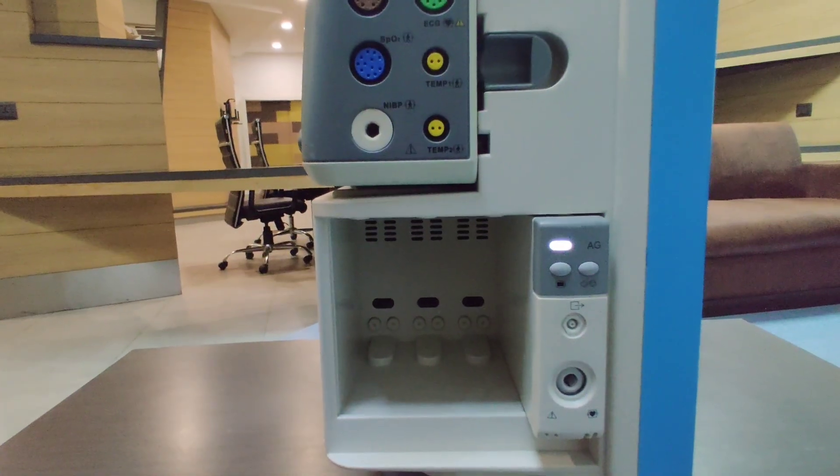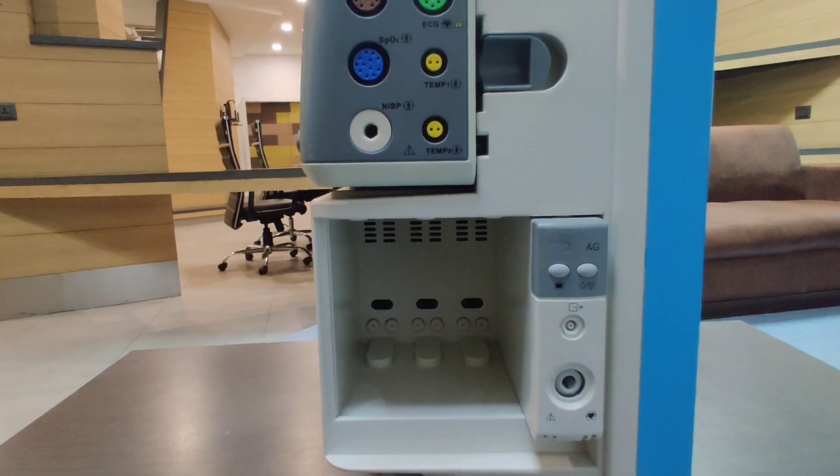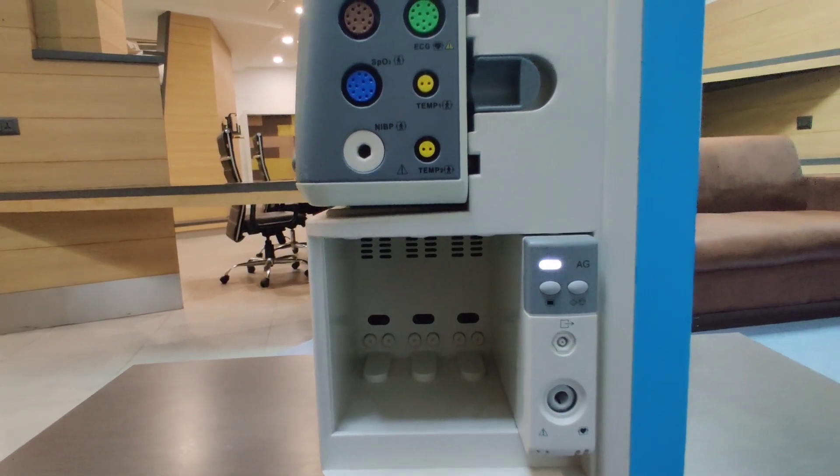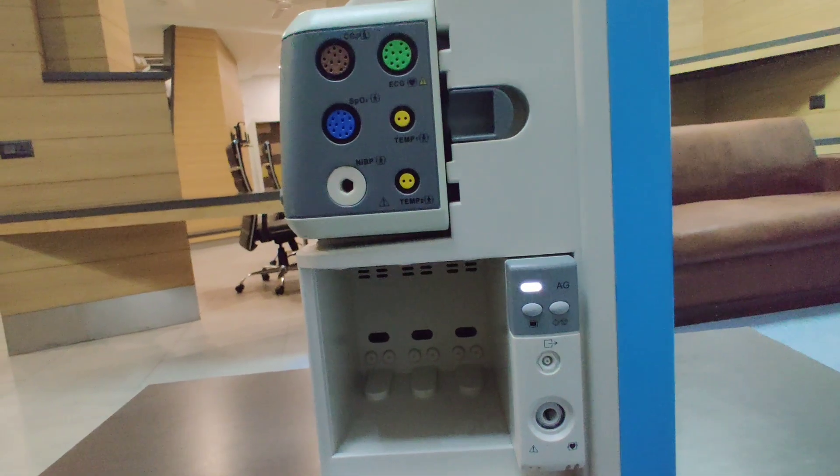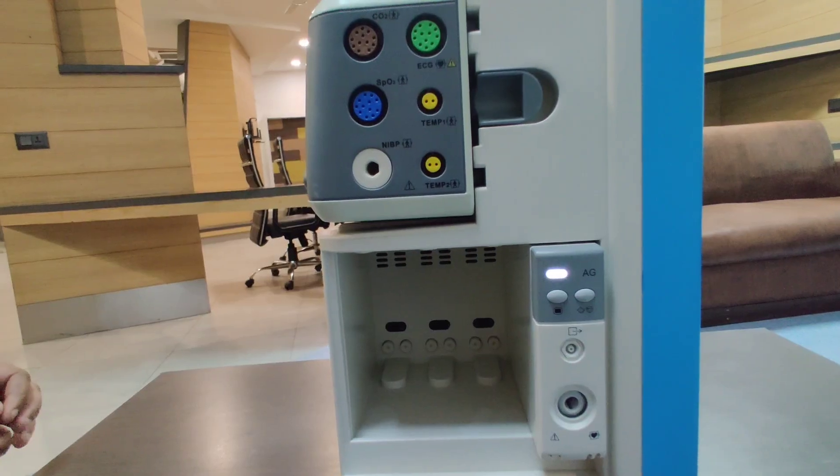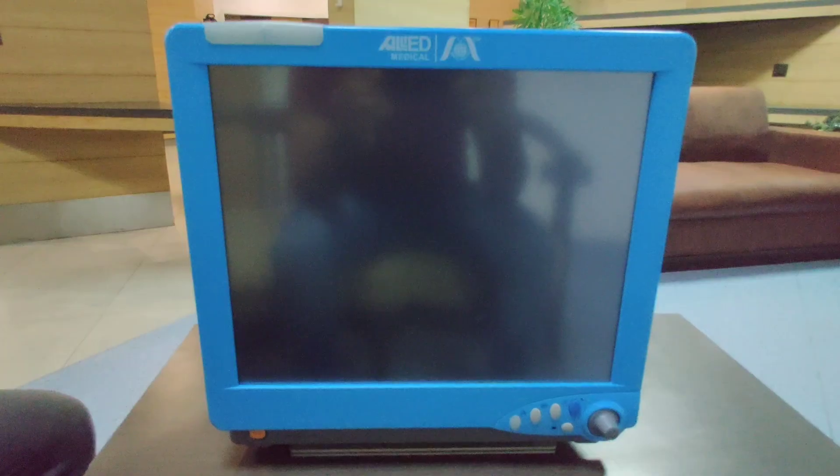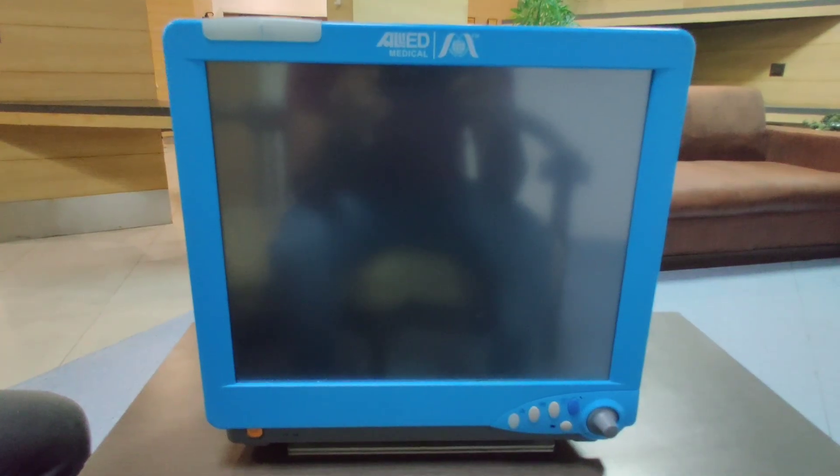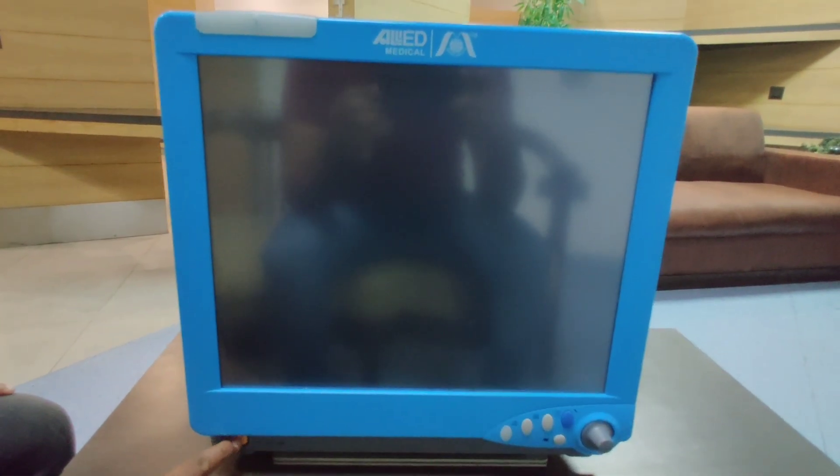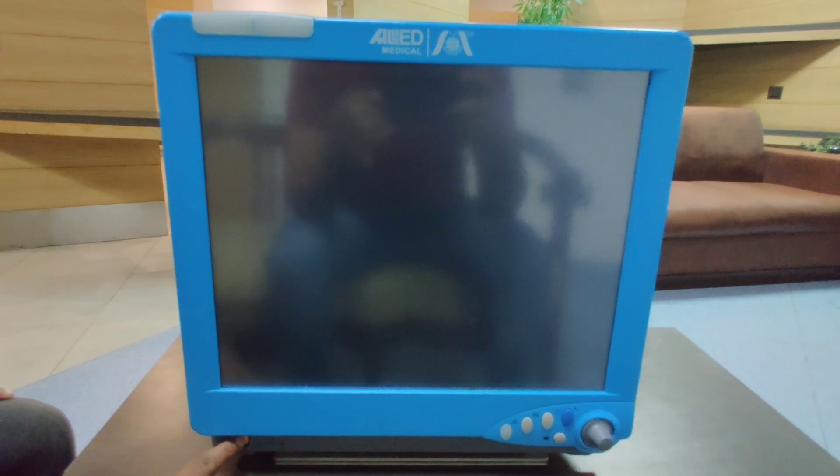This is the reason it is known as the fully modular monitor. For turning on the monitor, there is a button on the left side which you have to press and hold.